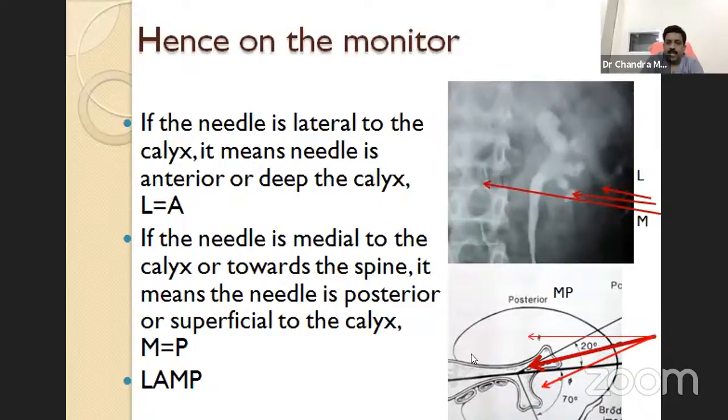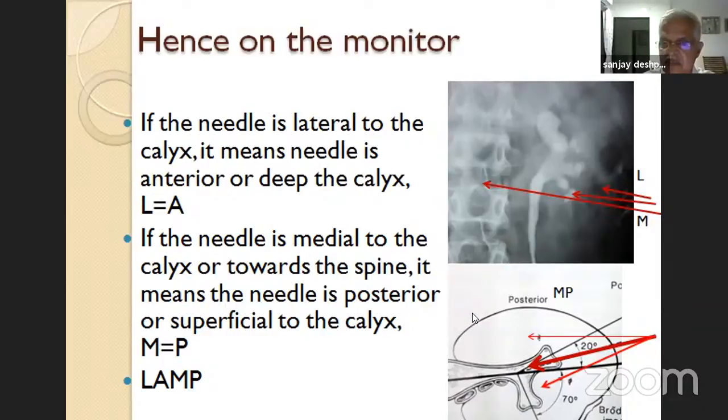Madhav Tiwari has asked a very important question: how to select the skin puncture site in the triangulation technique. If I am not wrong, it is blind. You have to assess approximately where to keep the skin site. Usually it is around 3 centimeters. However, if the patient is thin, it will be much nearer, whereas if the patient is thick or obese, it will be more lateral.